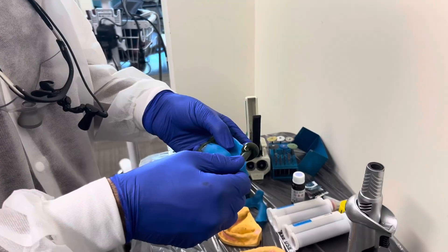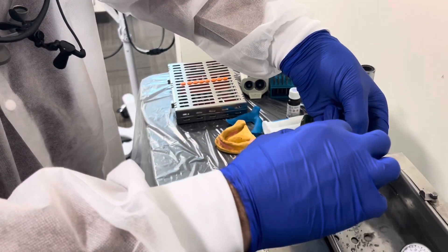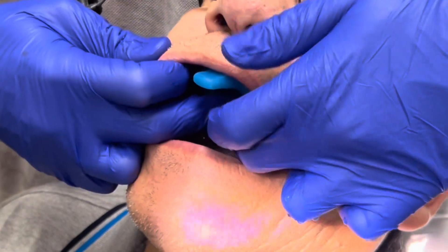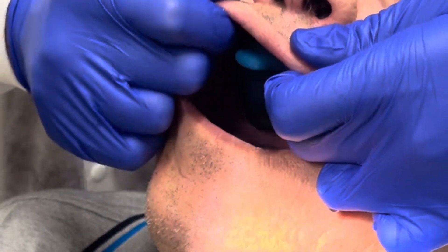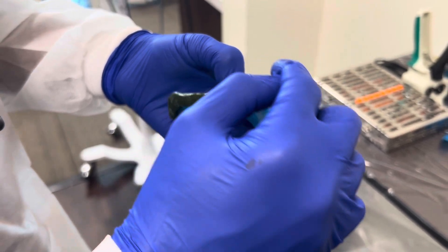Now we're going to go ahead and heat up another piece to be added onto the anterior buccal area. The custom tray is seated once more. To border mold the lip and adequately activate the frenum, I like to support the tray with my middle fingers and then using my thumb and pointer finger I border mold the lip. That way you adequately capture the depth of the vestibule and both frenums.